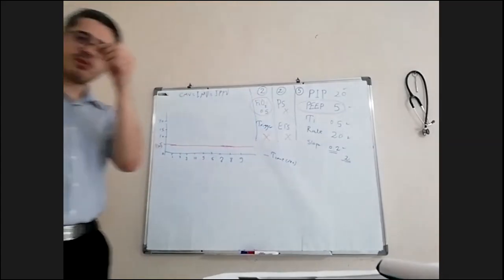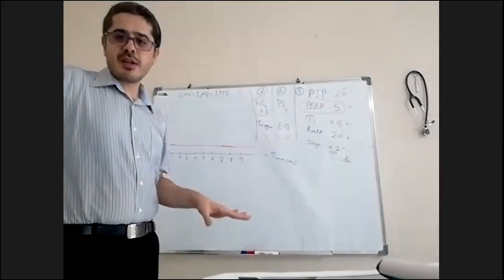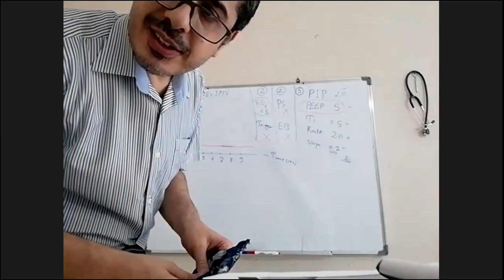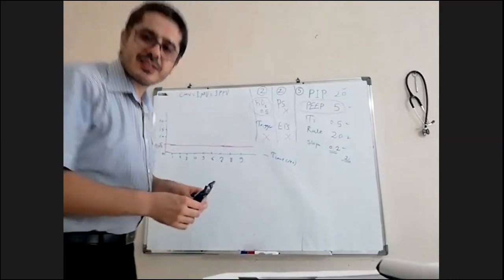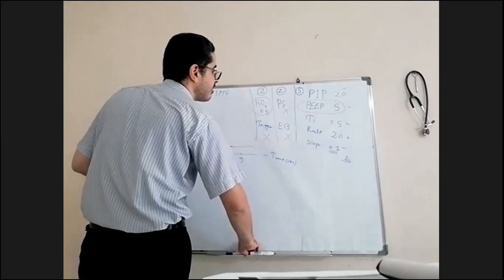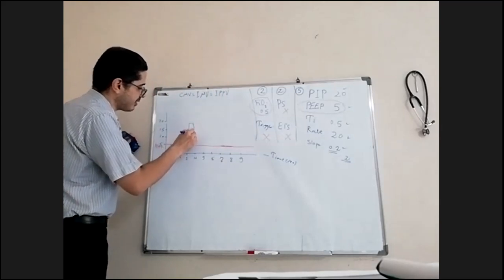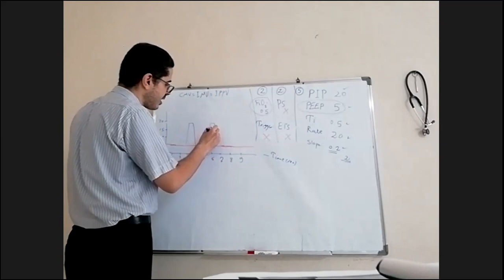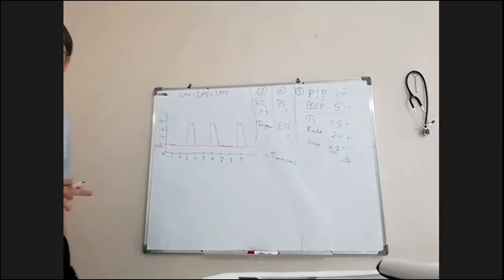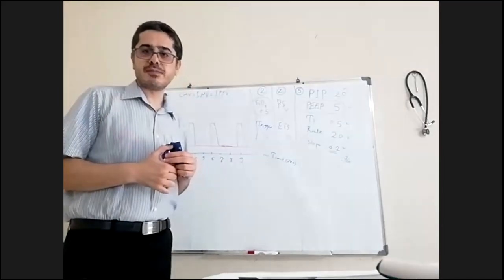If you go and see what CMV or IMV or IPPV is, it is the one that ignores the patient. This ventilator will give controlled breaths, 20 per minute, so every 3 seconds it gives a controlled breath. Time trigger, time cycle. So this will hurt the patient. If the patient has breathing effort, the patient would be hurt by this ventilator, a lot of asynchrony.